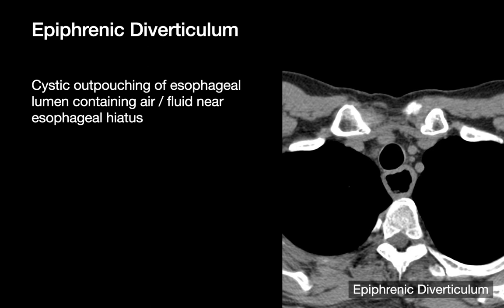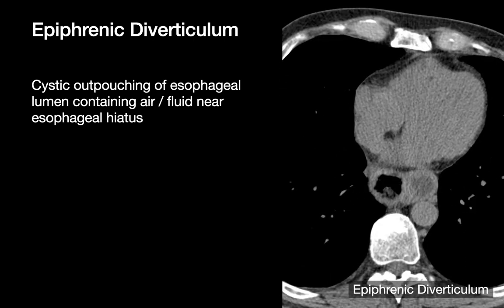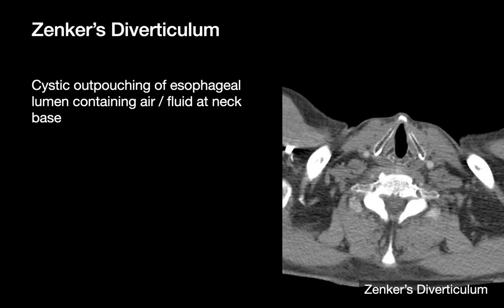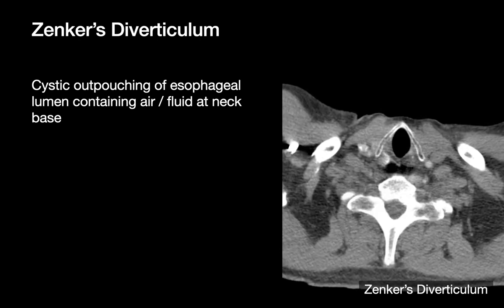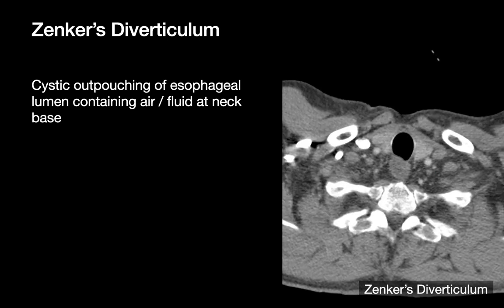Epiphrenic diverticula are focal outpouchings from the lower esophagus near the esophageal hiatus. Zenker's diverticula are small focal outpouchings from the upper esophagus near the neck base. In this image, the yellow arrow points to the collapsed esophagus and the pink arrow points to an air-filled Zenker's diverticulum.